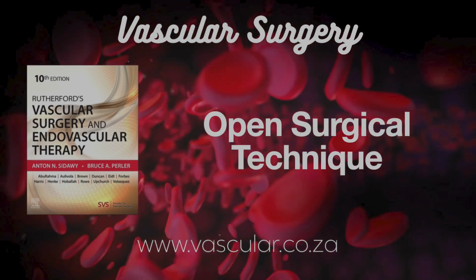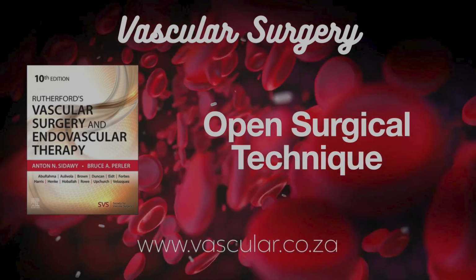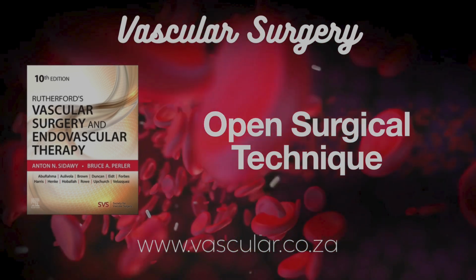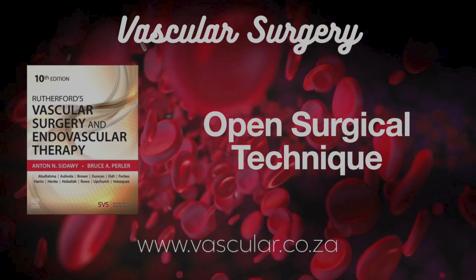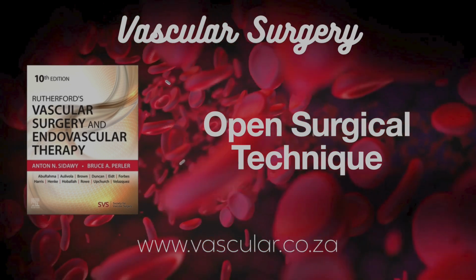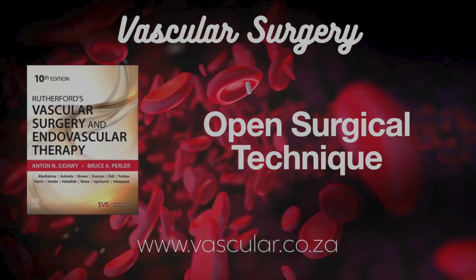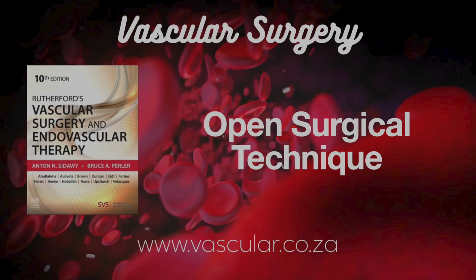Minimizing blood loss and preventing vessel injury seem paramount. How? For blood loss, often pass the balloon proximally first, just short of the lesion, inflate, pull back initial loose clot. Then, after crossing the lesion, allow brief, vigorous bleeding to flush debris. Repeat until good flow and no more clot on 2 passes. Controlling bleeding during catheter passage. Silastic loops snugged down can help. For grafts, maybe manual compression.